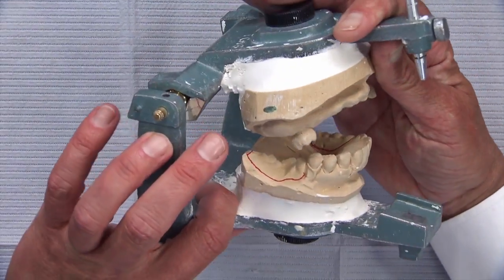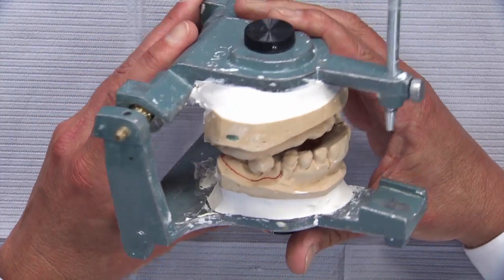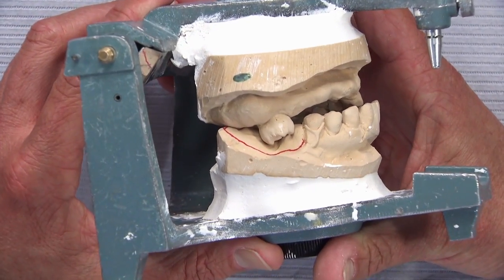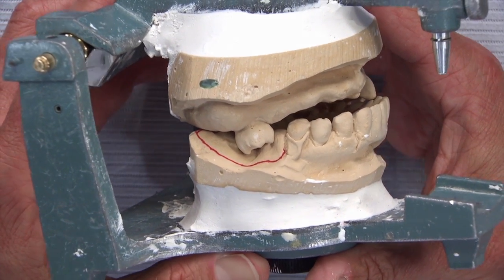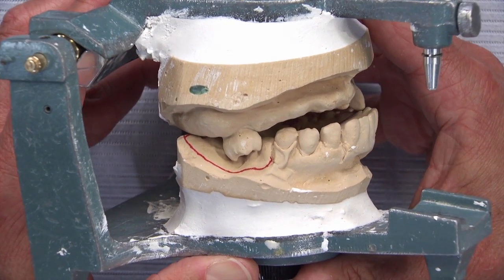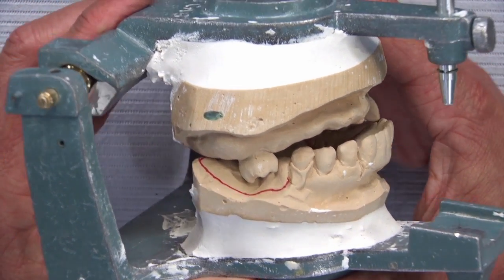And if we look, we can see there's little room for denture teeth from 3 through 5 at least. And you can see the class 3 arrangement that we have there. If we were to put denture teeth in there with this bite, the denture teeth would be very, very thin and most certainly fracture. Patient's coming back to doctor angry again.